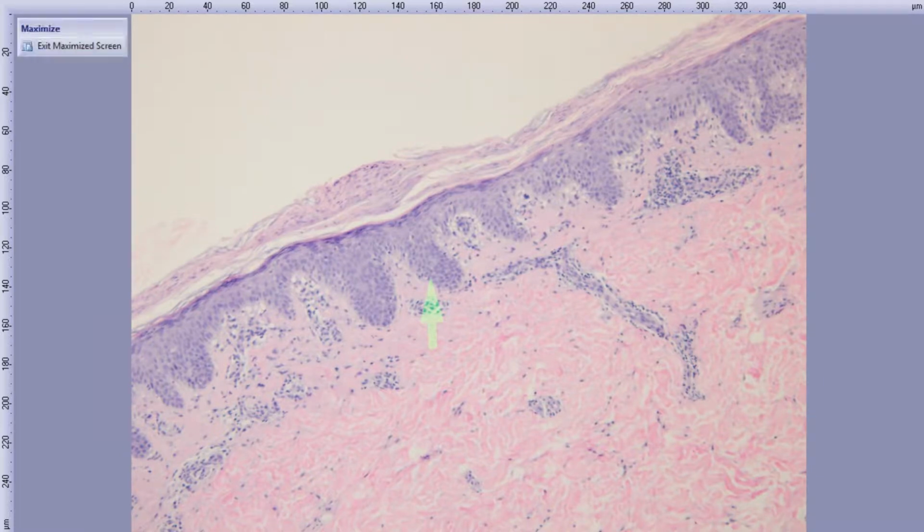Somebody mentioned Pityriasis rosea. It is a little bit of a mounding of the parakeratosis, but this sort of interface process is not typical for Pityriasis rosea, although rarely you can have some interface in some atypical PR cases.